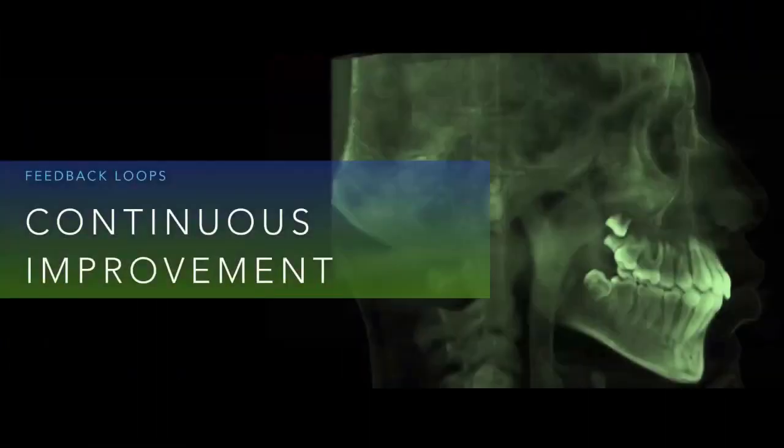So another great way that CBCT helps us is that it allows us to continuously improve. John Price is another great friend of mine who said the best way for you to improve as an orthodontist, Jay, is to look at your records and be critical of your own treatment.